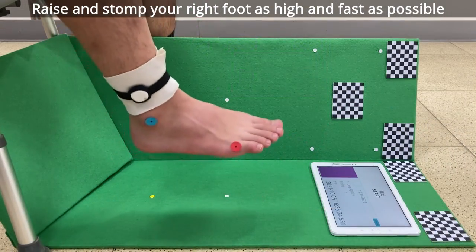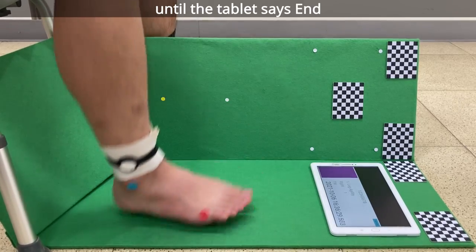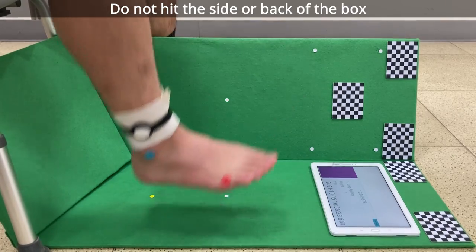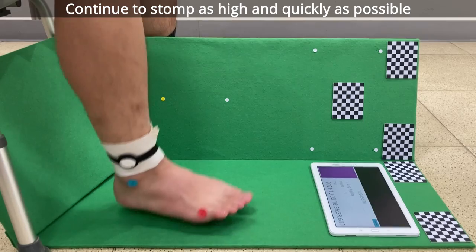Raise and stomp your right foot as high and fast as possible until the tablet says end. Do not hit the side or back of the box. Continue to stomp as high and quickly as possible.